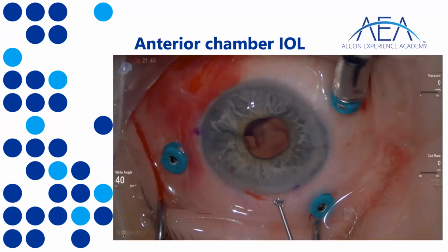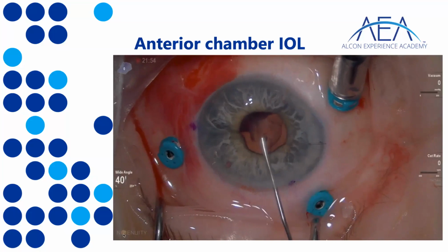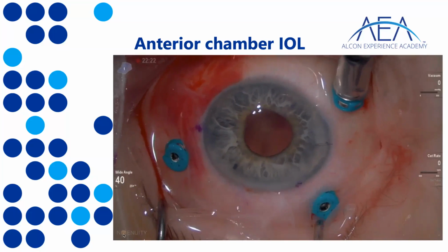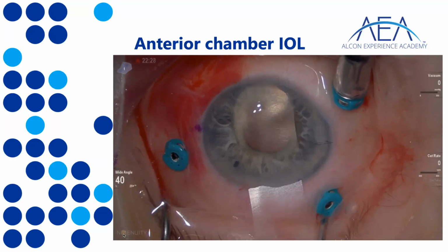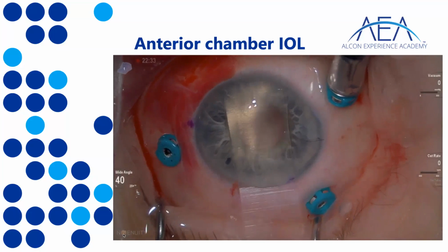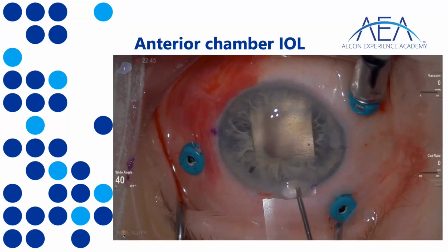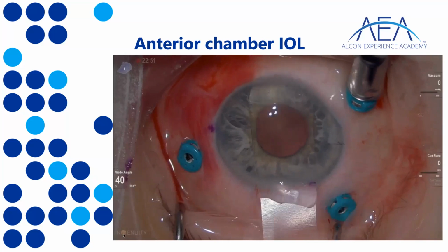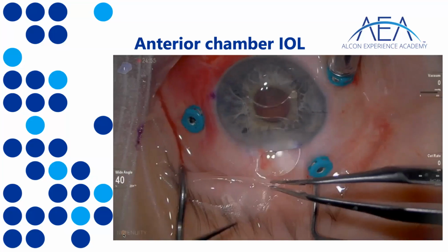Some viscoelastic is helpful to create and maintain the anterior chamber, and in this specific video the surgeon decides to use a small slide. This is something that can or cannot be used. It's absolutely not mandatory. It's just something which can make your life a little easier if you have it, and it's entirely at the surgeon's preference. Again, some viscoelastic on top of the slide will help with the lens, which is then slid inside using this device.